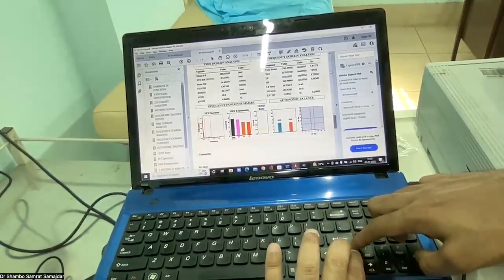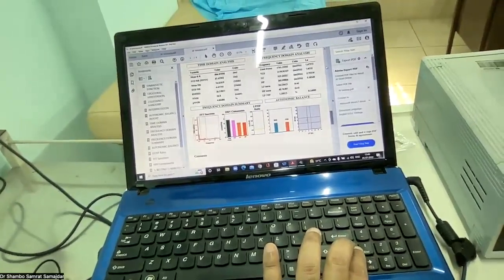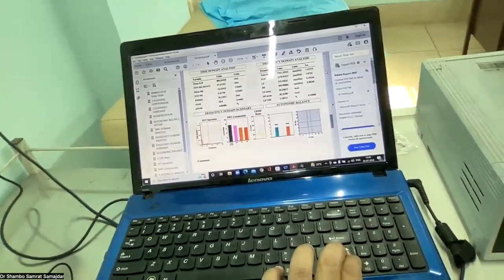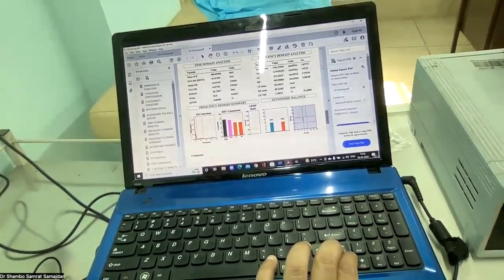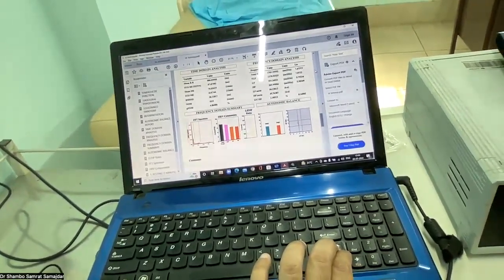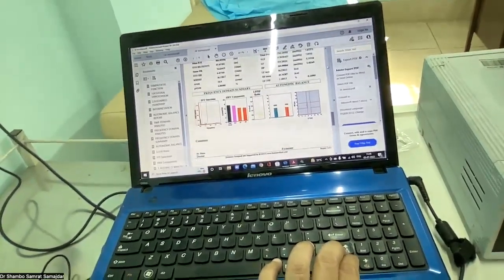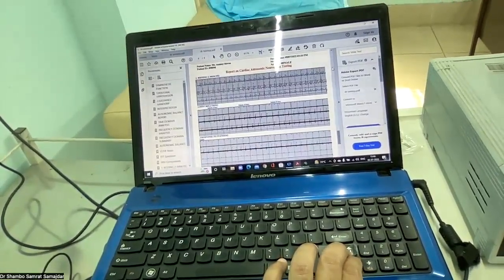So here you can see the LF value. These are the logarithmic scale. So what they are maintaining, the sympathetic nervous system function is a little bit more compared to the parasympathetic nervous system function. But again, this needs to be interpreted with some caution. So these are the other reports. So this is by which we can test autonomic neurofunction.